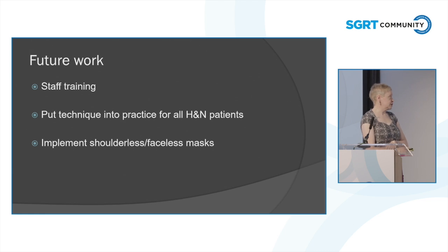So, future work, staff training. Kid you not, it's happening right as I'm stood here, because I got a message from one of my colleagues this morning saying, good luck with your talk, I'm planning a head and neck with couch kicks as we speak. So she's actually taken it and run with it. But we are going to roll it out for all head and neck patients because the results show that it is significantly better. And we're also going to tie it in with sorting out any problems we've had with the shoulderless, and then maybe move to faceless masks.